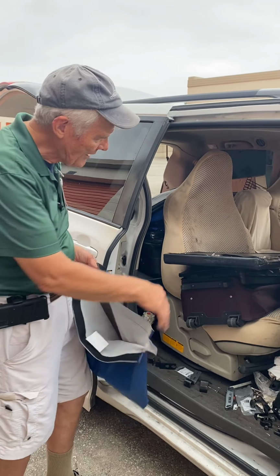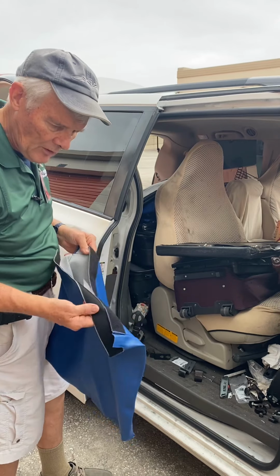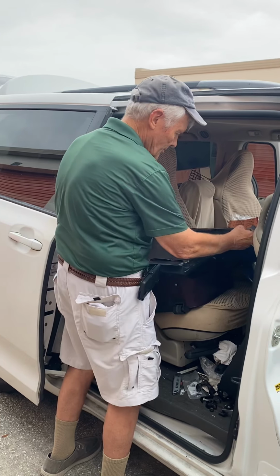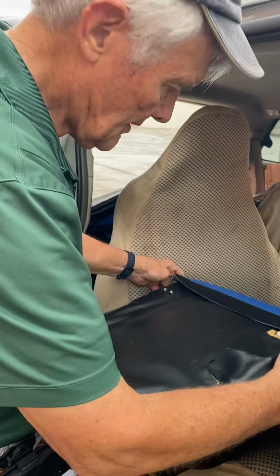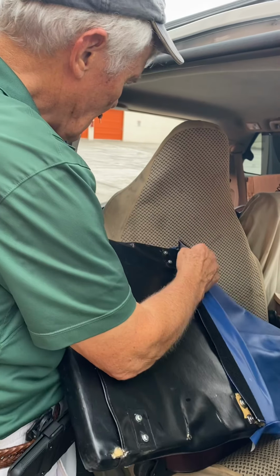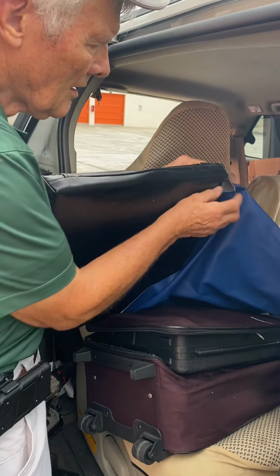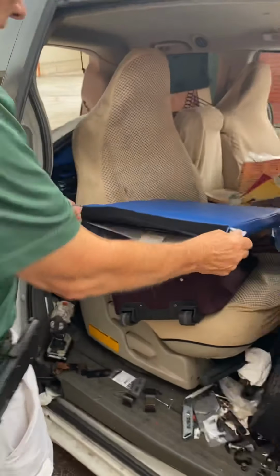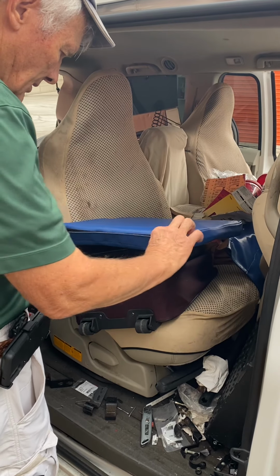And as I put it on, I've got the bottom on the top and the Velcro sticky part on the top because it's going to fold over this way. It goes on, you can see, you take over my shoulder. Then these two little flaps go in. If that goes down, you start from the middle and work out.